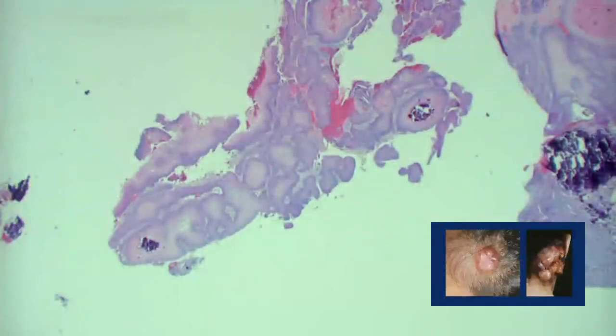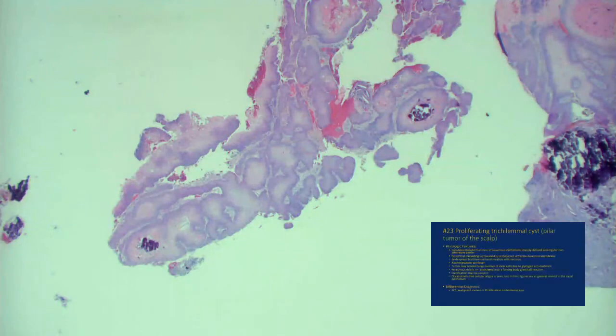They can sometimes be really pretty large, like that large lady's ear. They mostly occur on the scalp, but also other locations. There can be calcification, even ossification. So anyway, just remember this lesion, also called a wen. In the old country, they used the term wen for it. This is a fantastic, beautiful, superb example of this also.